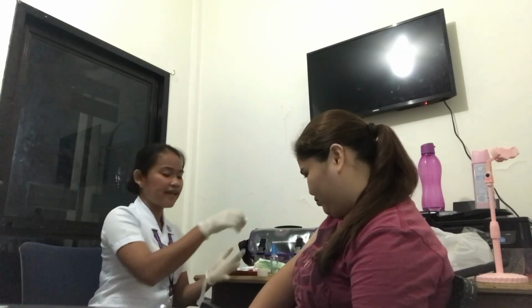So now we're going to help the patient find the comfortable position that will accommodate the injection site we've chosen. We need to expose only the portion of the body at the injection site. So now we're going to apply clean gloves and use anatomical landmarks to find the site again. Now we're going to hold the gauze pad between the third and fourth fingers of our non-dominant hand. And also we need to remove the cap by pulling it straight off, and hold the syringe with the thumb and forefinger of your dominant hand as you are holding a dart.